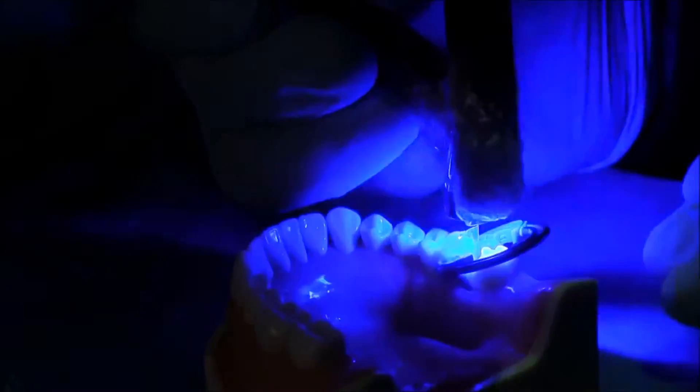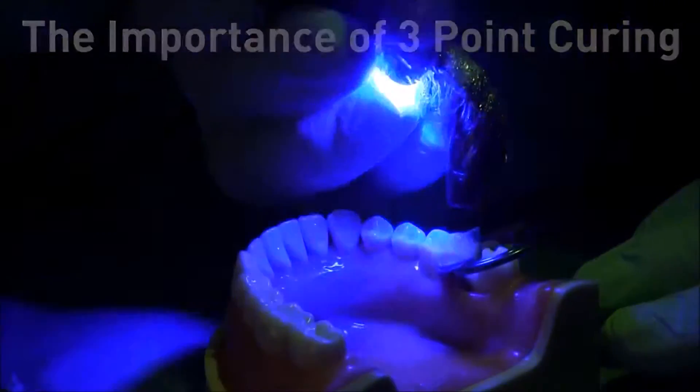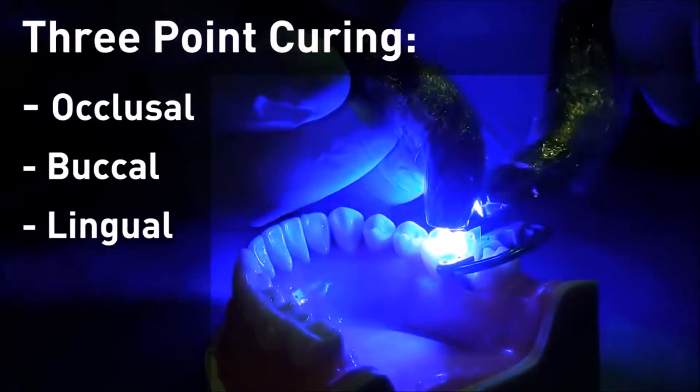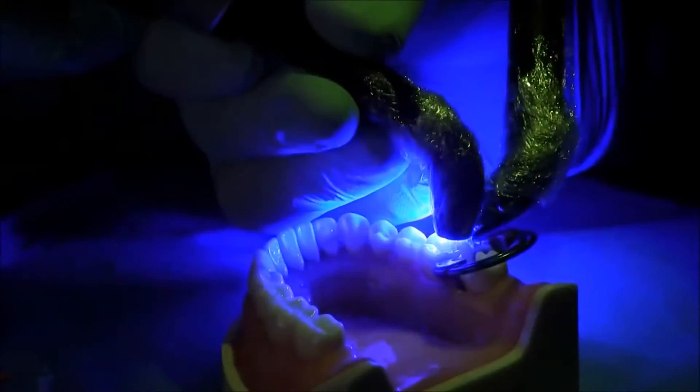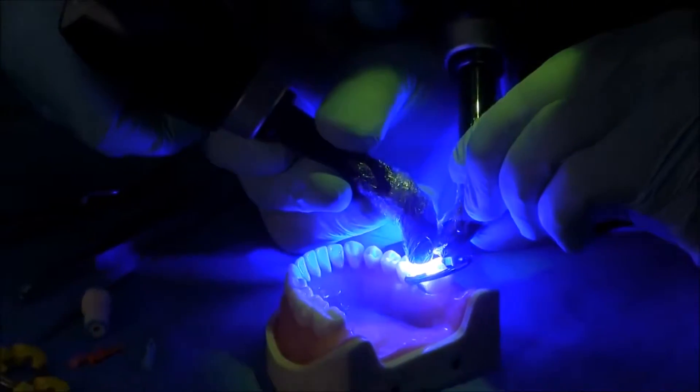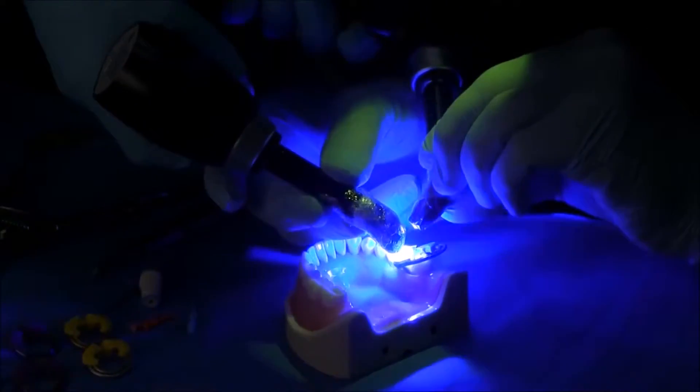True bulk filling requires three-point curing — curing from the occlusal, the buccal, and the lingual. A clear matrix is a distinct advantage: it allows more confidence that we have a full cure, and fewer layers are required.